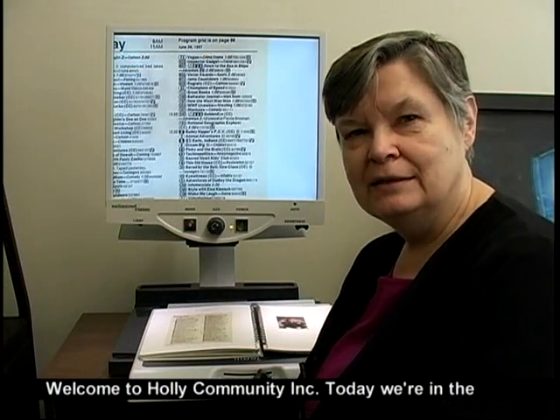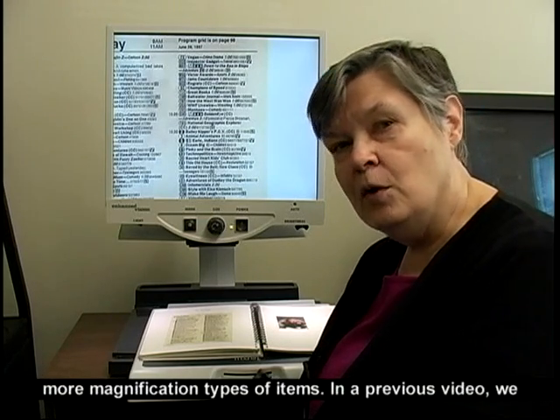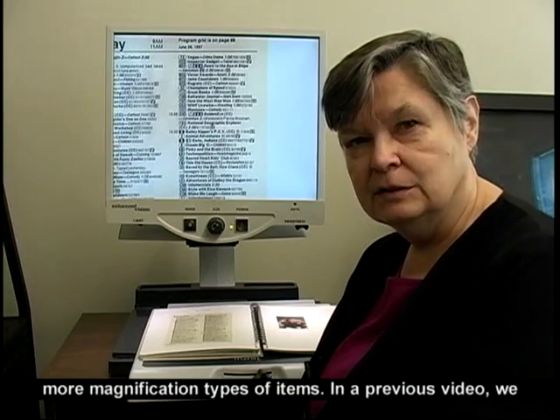Welcome to Holley Community Incorporated. Today we're in the demonstration center and I wanted to show you a few more magnification types of items.